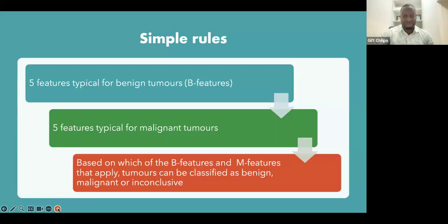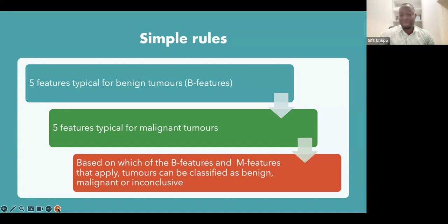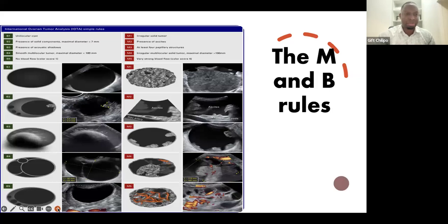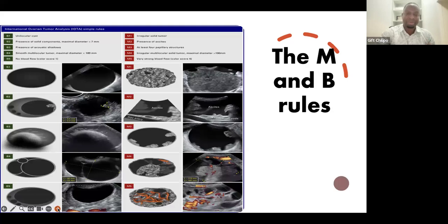So what are these simple rules? There are five features typical for benign masses and five for malignant. The rest that are not classified are called inconclusive, where further imaging or a more experienced clinician can be called upon. The first five benign B features: B1 — a unilocular cyst with nothing inside; B2 — presence of a solid component or papillary projection measuring less than seven millimeters, which is a good sign; B3 — acoustic shadowing present.